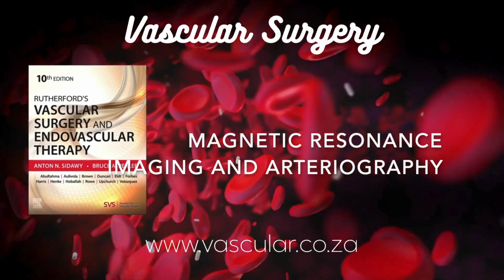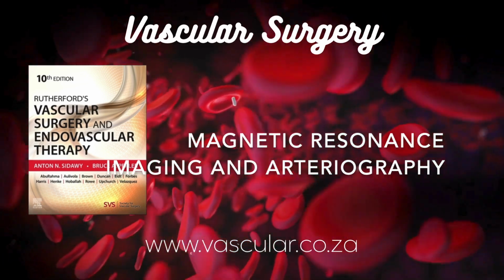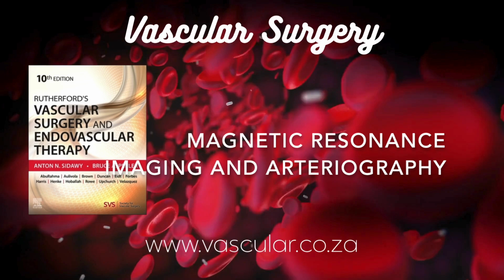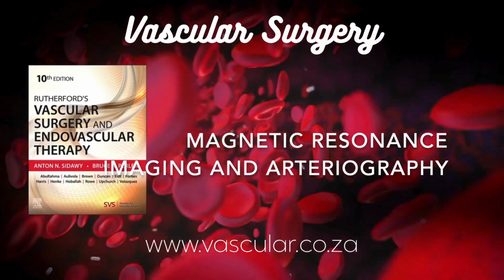Ah, so the contrast makes the blood bright on T1 images. Exactly. So as a rule of thumb, if something looks bright on a standard T1 weighted image, it's probably going to look bright on an MRA image too, especially if contrast is used. Got it. MRA uses T1 weighting to make vessels pop out. Now, the outline mentions pulse sequences. Sounds technical. What are they?